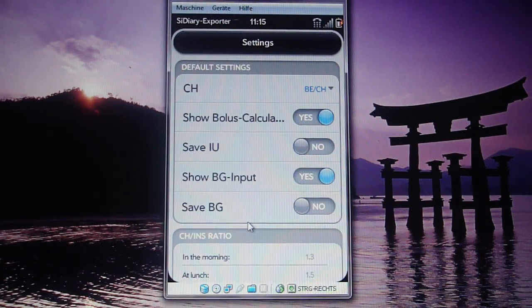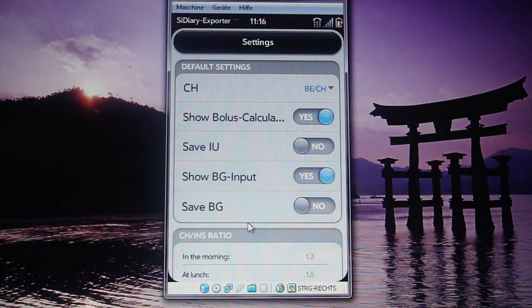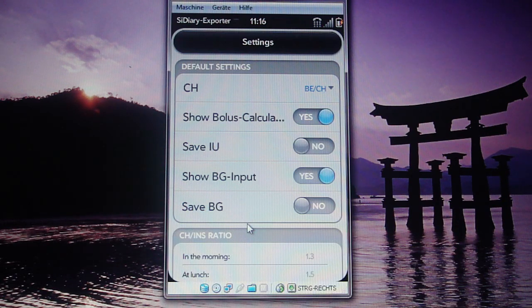Hello, this is Lars and I'm going to show you my tool SiDiary-Exporter, how it works, and how it works together with the online and PC version of SiDiary. I will show you that on my emulator here because I think it looks a little bit better than showing it on my real device.